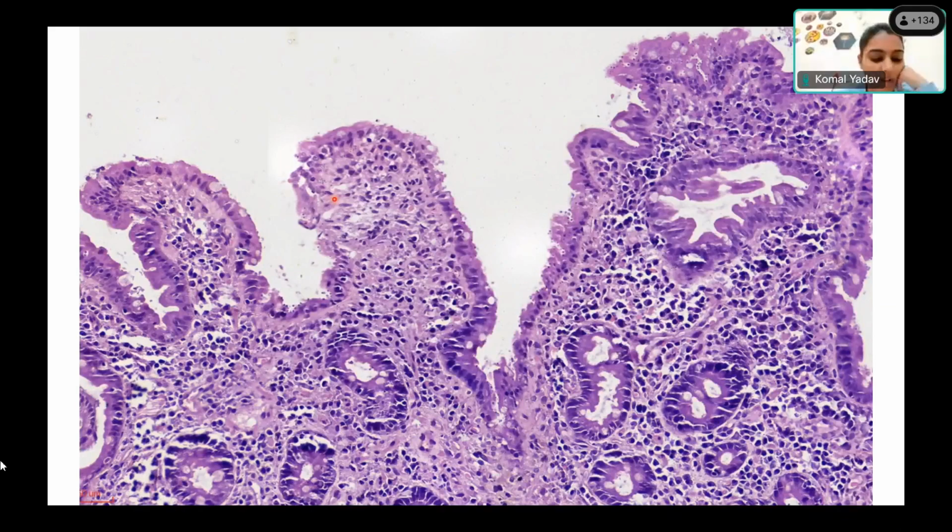Ma'am, section examined reveals mucosal lining epithelium. There is a conspicuous presence of tiny coccidia at the apical surface. The underlying lamina propria shows a dense mixed inflammatory infiltrate. My differentials can be, firstly, cryptosporidiosis. Correct. Ma'am, other we can think of according to the clinical details, this malabsorptive diarrhea, in which we can see celiac disease, tropical sprue, Whipple's disease, but we have to further investigate the patient.